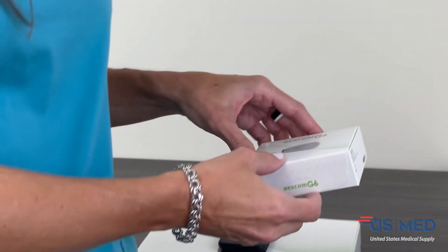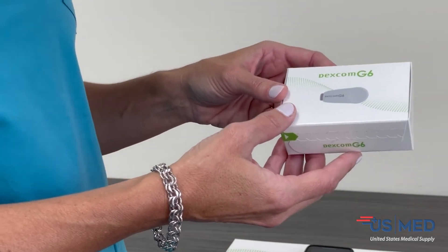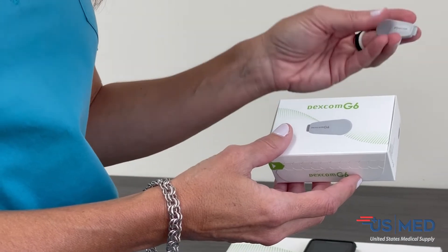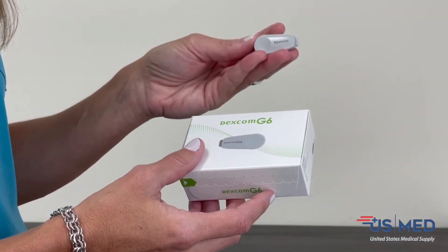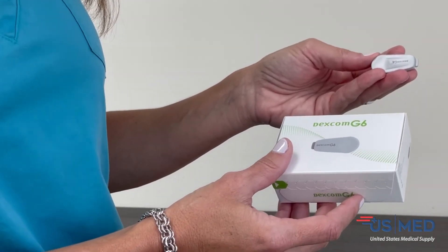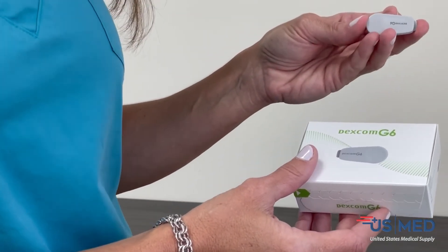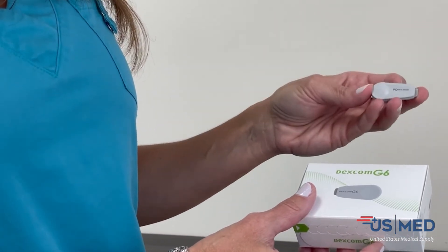Then we have the transmitter, which is a small little device that will click in once the sensor has been applied. This is kind of what seals the deal — the transmitter will send the signal to the receiver, and every five minutes you will have the glucose numbers going into the receiver.